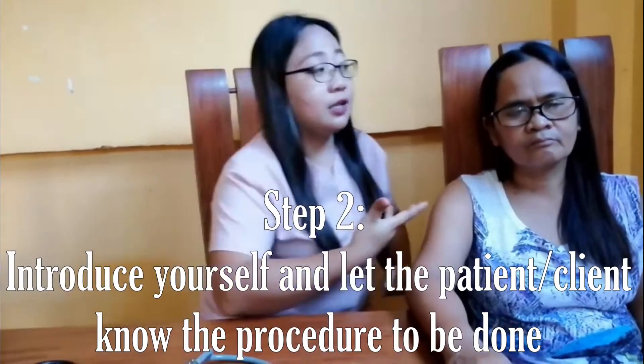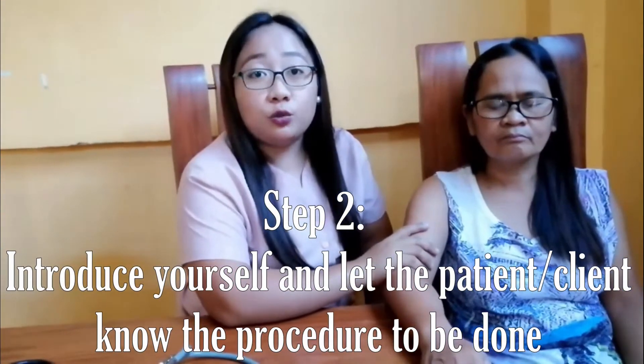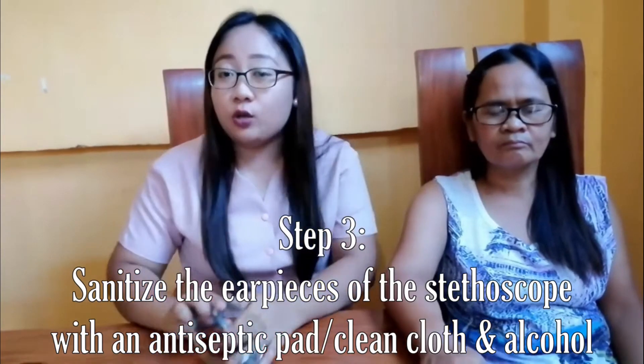Number two: introduce yourself and let the patient or client know the procedure to be done. Say: 'I will get your blood pressure using the BP apparatus.' Number three: sanitize the earpieces of the stethoscope with an antiseptic pad or alcohol.